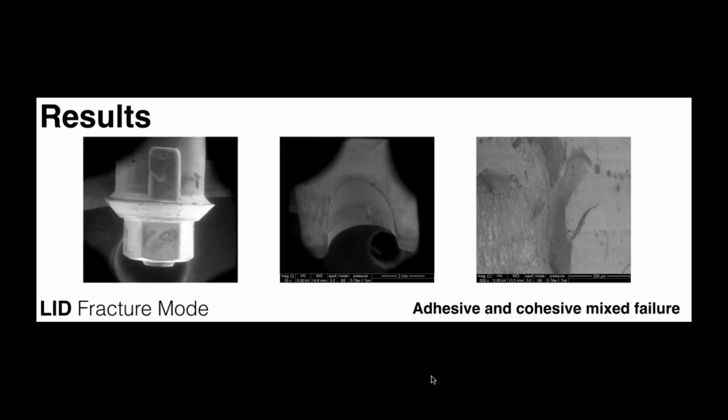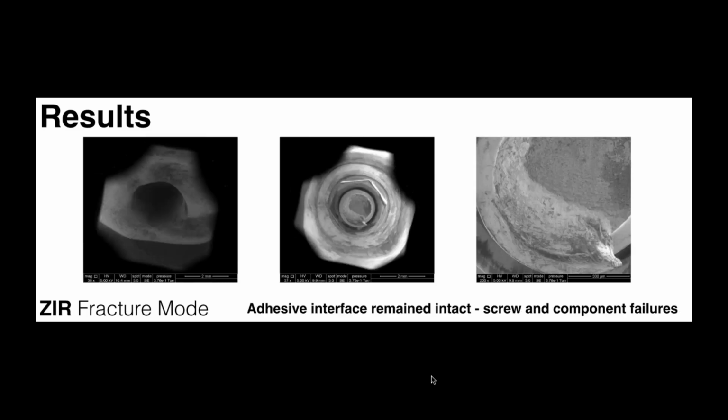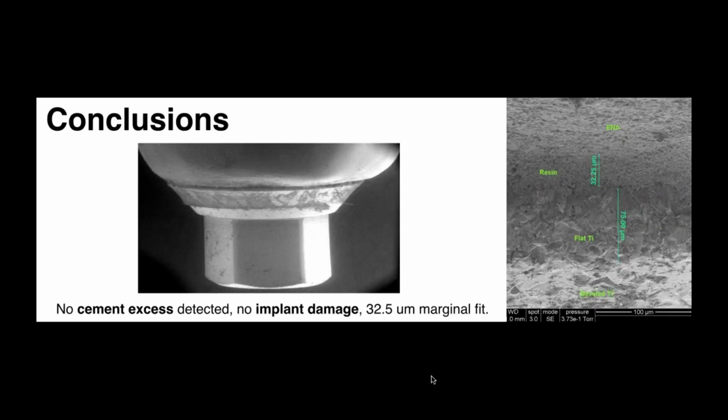We also tried lithium disilicates, and we also tried the zirconium oxide that was available at that time for this indication, which was a first generation zirconia, a very hard and opaque white zirconia, indicated for mesostructures, for custom abutments, not for monolithic crowns. But here we can also see that with the APC concept, we're able to bond properly to this tie base. Once we apply the APC to the titanium, then we just need to see what the outside material is and what is the best method to bond to these different types of materials.